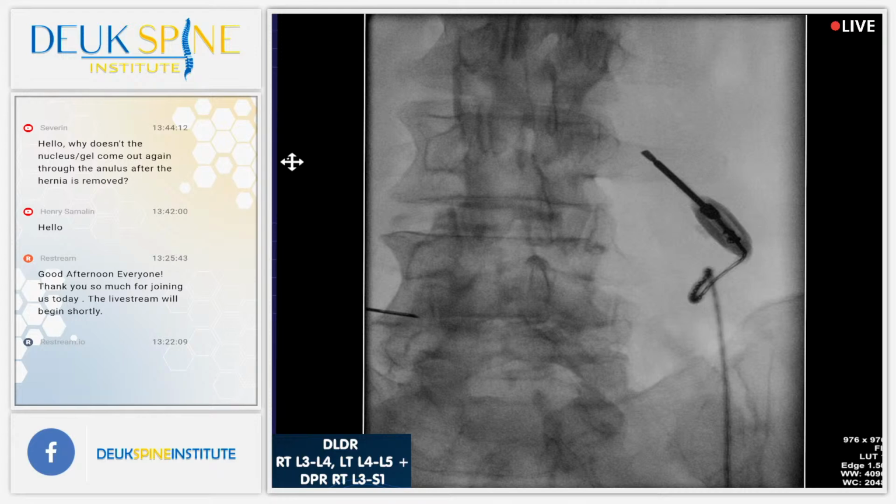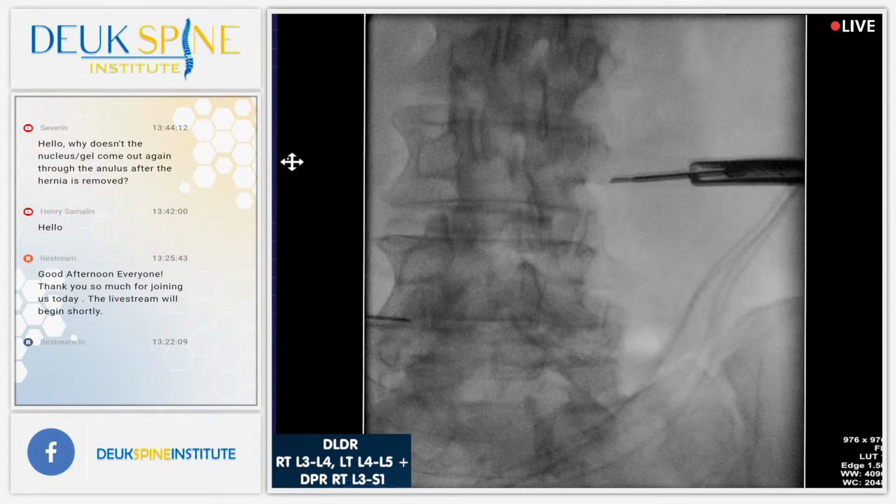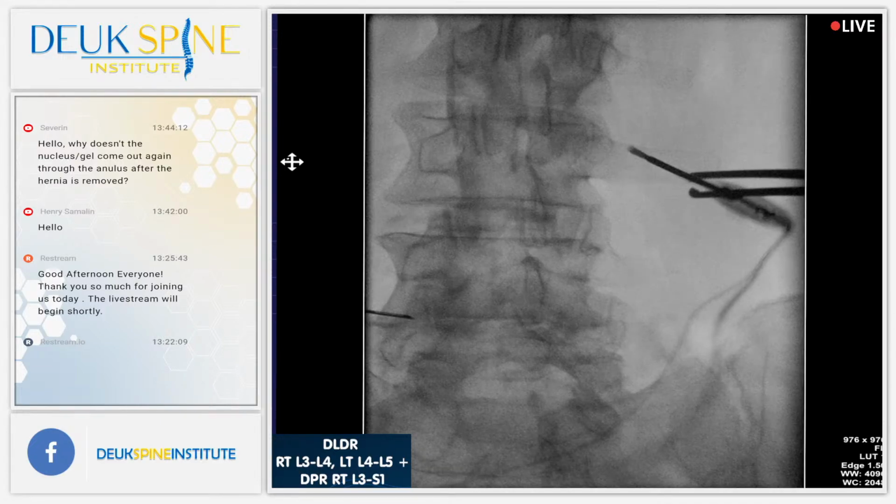And I want to go medial. Oh, stay there. Stay there. Where are you going? Huh? Shot? Where were you headed? Shot? Man, just a tiny movement is incredible. Shot? Right? How much you get. That is the spot. So I'm actually killing his pain nerve at the L3. And it's called the medial branch of the dorsal ramus. That's good. They all are. But take your time. We're good. He's doing great.